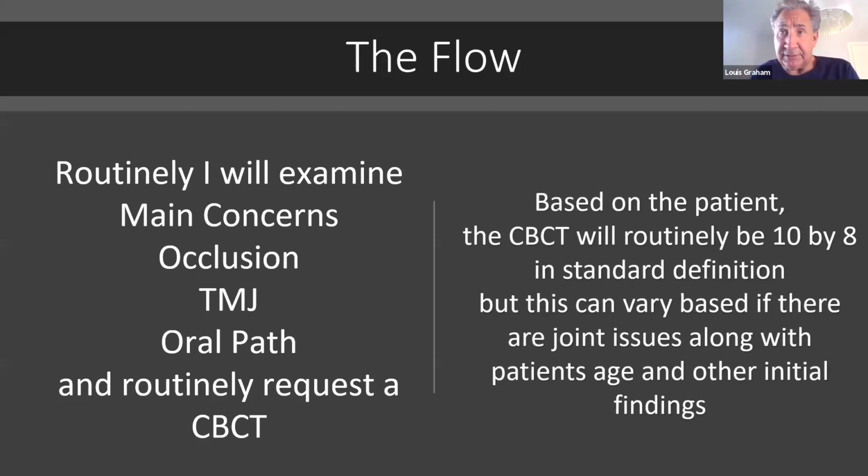Now you think about this. A 10x8 cone beam, as you'll see, takes 7.7 seconds once the patient is aligned. 7.7 seconds with no discomfort, versus doing a full mouth series of x-rays with those sensors. Are you kidding me? I hate those sensors. So it's a much more pleasurable experience, much more pleasurable.